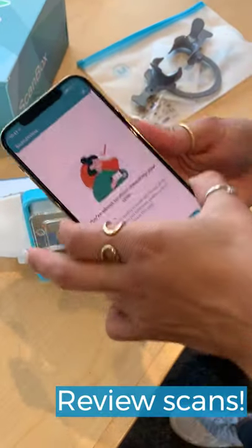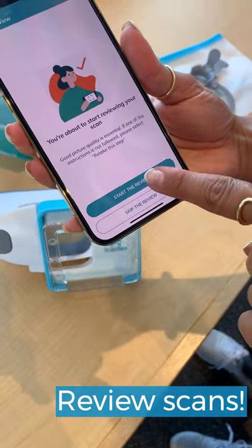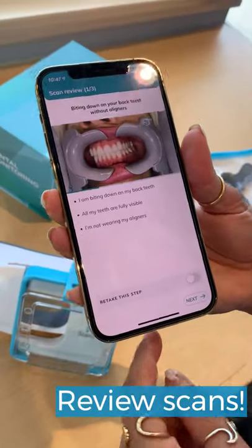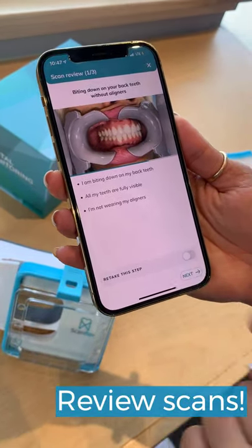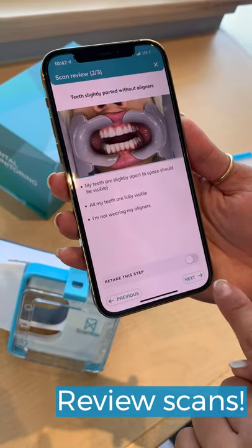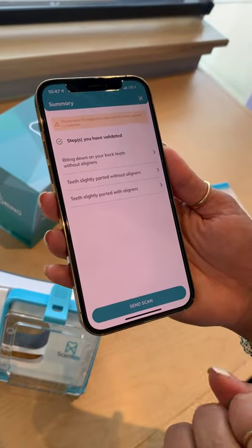Afterwards, take your phone out of your scan box. You can review all your scans and if they look good, you can submit them. It's important to make sure your scans are correct so you don't have to retake them.